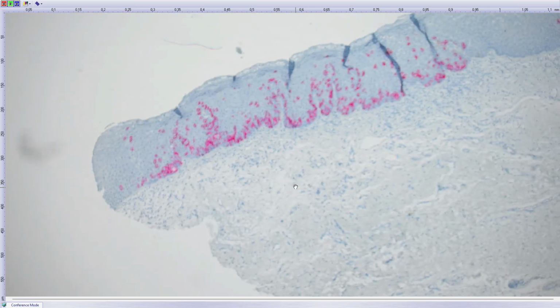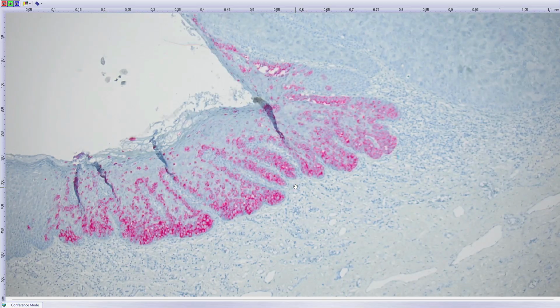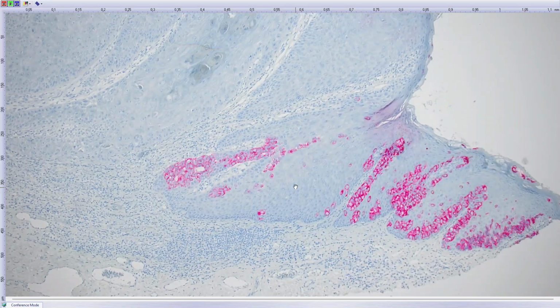I will show cytokeratin 7, I think, which very nicely shows the pathology. Look, cytokeratin 7, yeah, which is typically negative in squamous cell differentiation. The biggest part of that lesion is negative, but at the shoulders of the lesion you see very nice positivity of this lesion. Yeah.